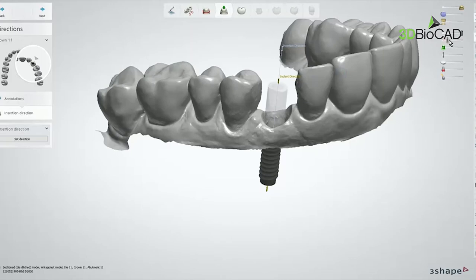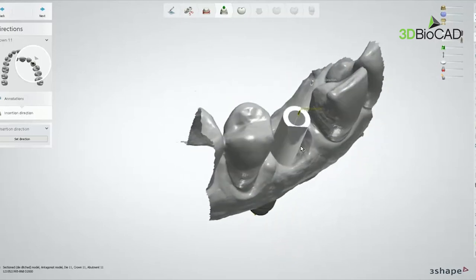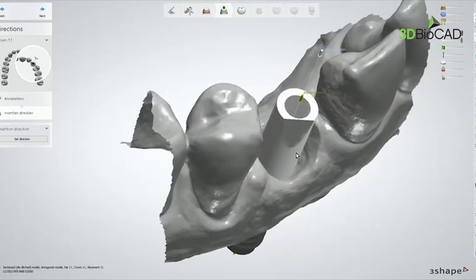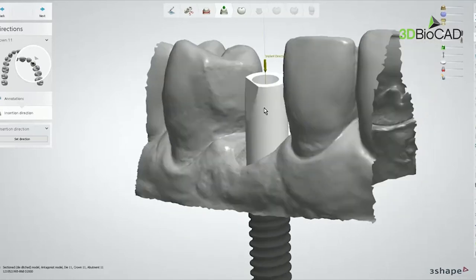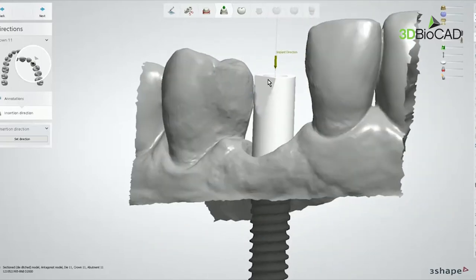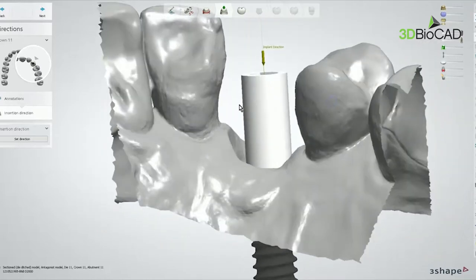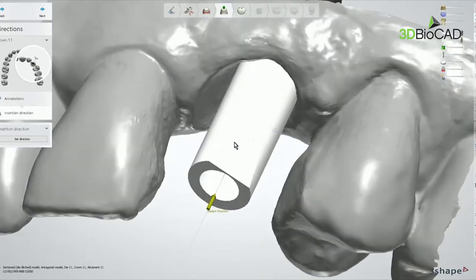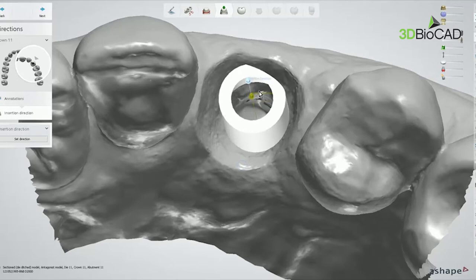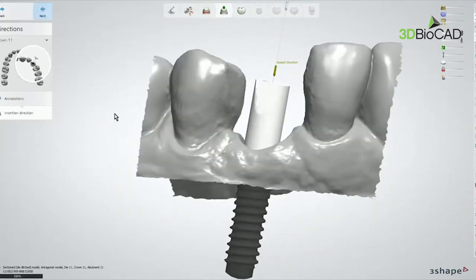So on the chairside, if you're a doctor, make sure of your scan body. The most important part is every scan body, intraoral scan body or lab scan body, doesn't matter, we have some reference points. So for this Straumann one, we have some cutting space here, like a surface here. This spot, please take it no matter what. And on top, the ring area, please take with your scanner no matter what. And on top of the scan body area, please take as much as possible. So this cutting area and top area are the most important for referencing and merging the scan body images and the library scan body. Okay. Lab scanner, same thing. Let me go next.